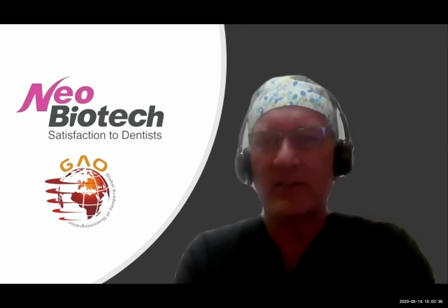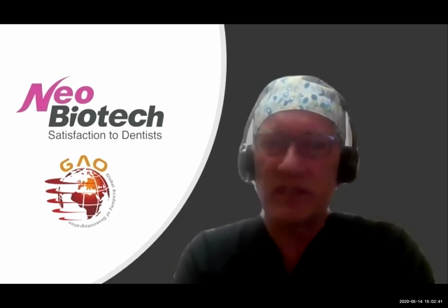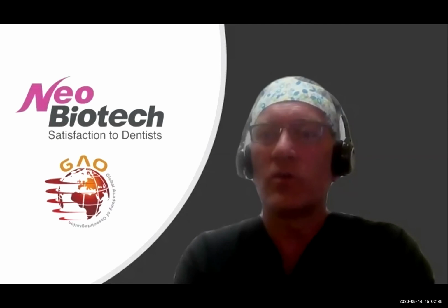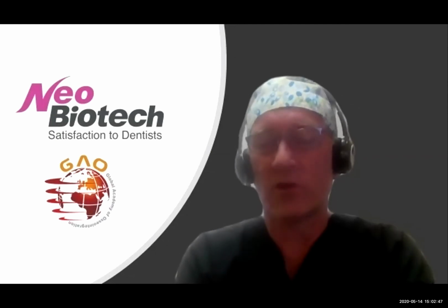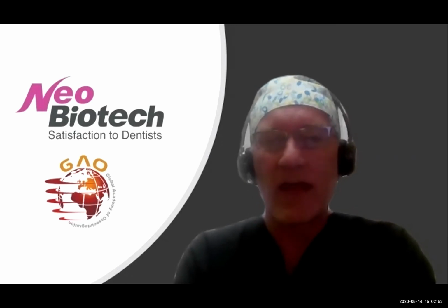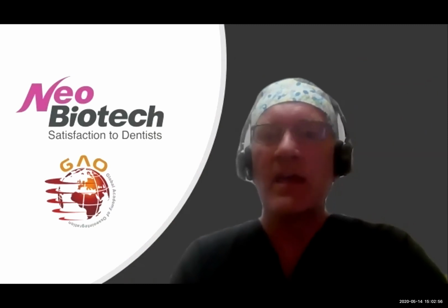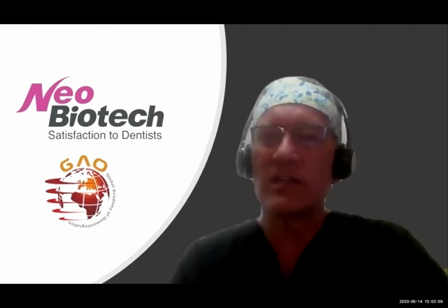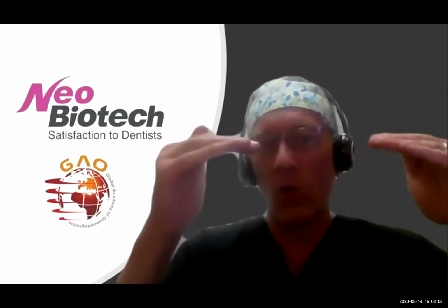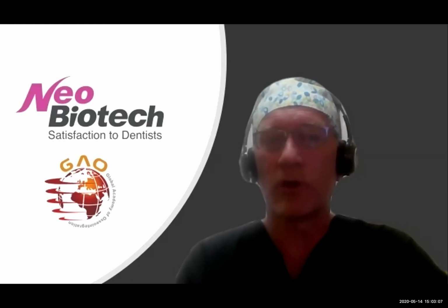What I typically find is that patients are usually more gentle than they actually need to be. With this technique, they don't have to be as gentle as they would with other bone grafts. Now, I don't want to put a denture on top of this. I don't want to do this and then have a denture fitting right on top of that. If you're doing a full lower jaw, you need to do some temporary implants that are going to support or hold that denture up above the ridge itself while that bone grows.